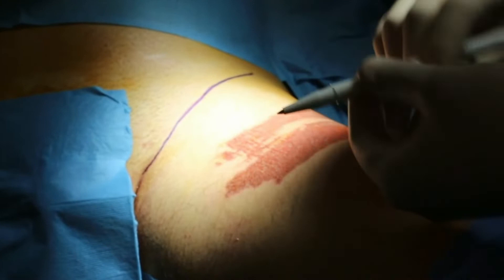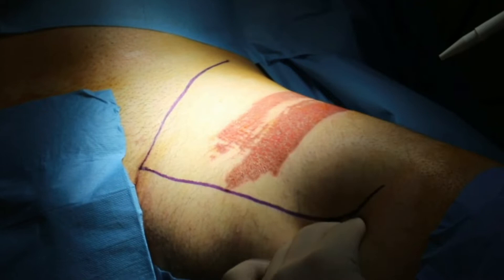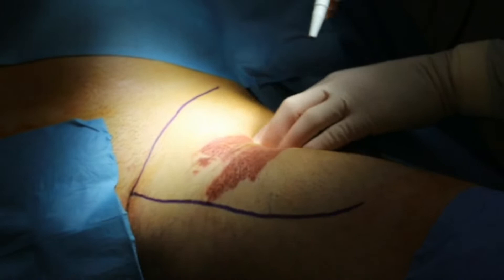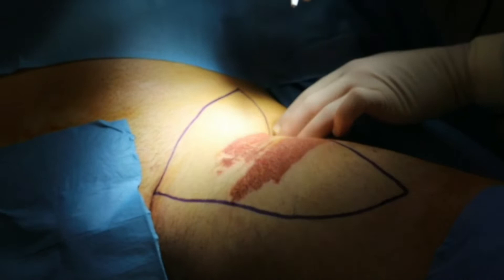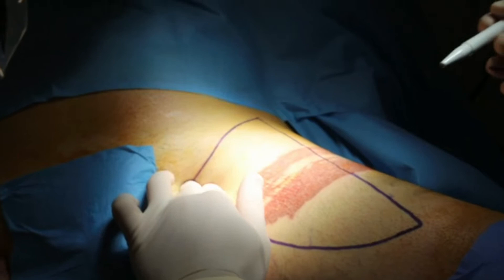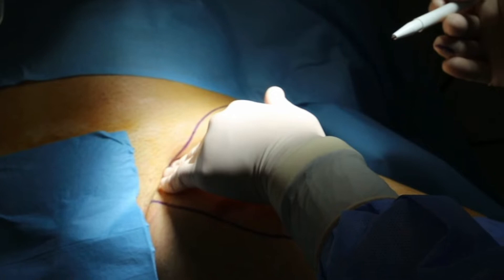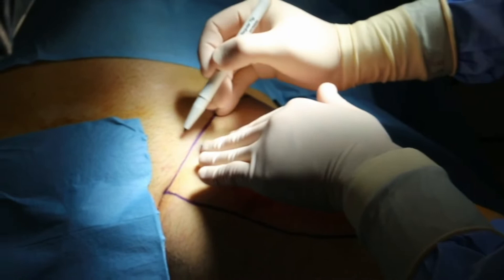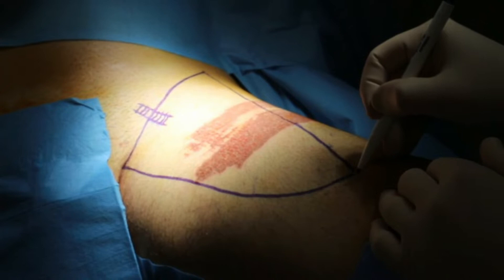Before placing the trocars, I think it's very important to mark the landmarks of my surgical field of the groin. Cranially we will have the inguinal ligament or Poupart's ligament. Medially I have already painted the landmark of the long adductor muscle, and laterally we have the sartorius muscle. It's also important - and I like to always do this - to look for the beating of the femoral artery. I think it's very important to have a reference for where the femoral artery is located, as it will help me a lot during the dissection. Using transillumination, my assistant can tell me if I'm lateral or medial to the artery.